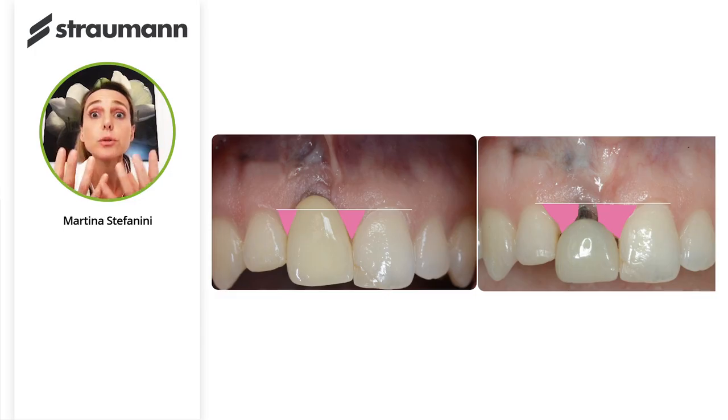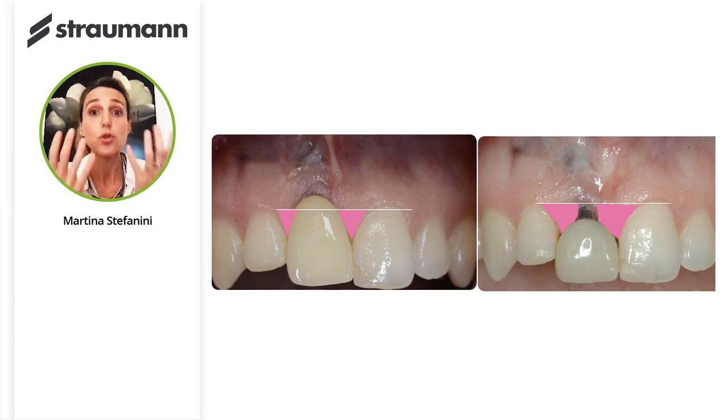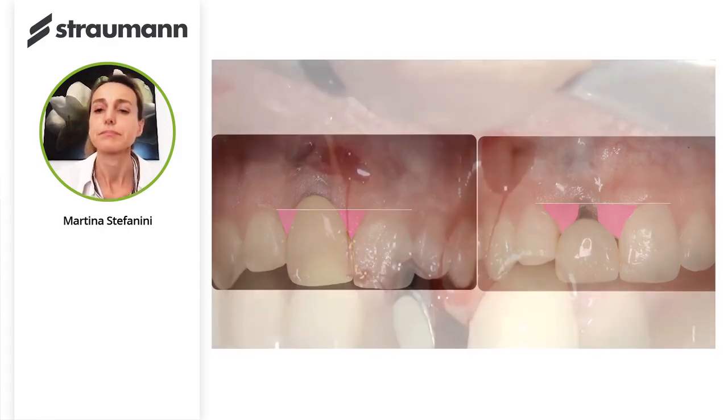And as I told you, the anatomic de-epithelialized papillae represent the heart of our surgical procedure because they give the vascular supply that will ensure the survival of our coronally advanced flap. So this pre-surgical step is of paramount importance to obtain a final optimal result.